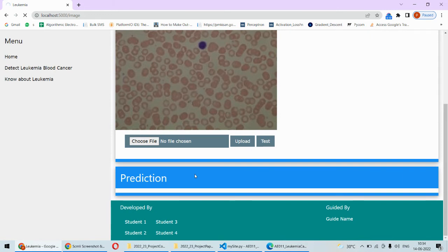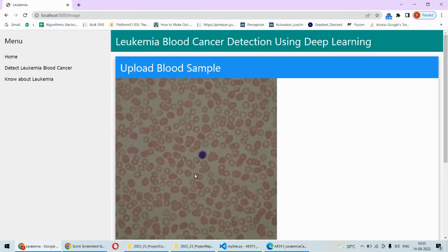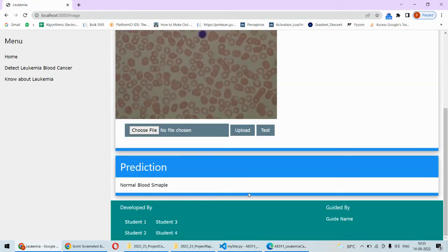It takes some time as we are using convolutional neural network. So it's a normal blood sample. This is all about the implementation part of this particular project.